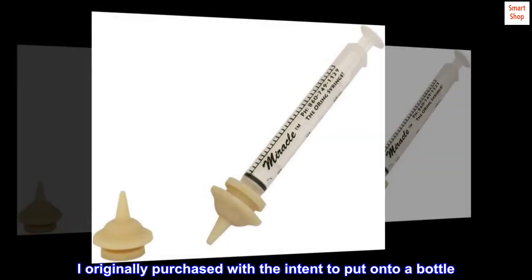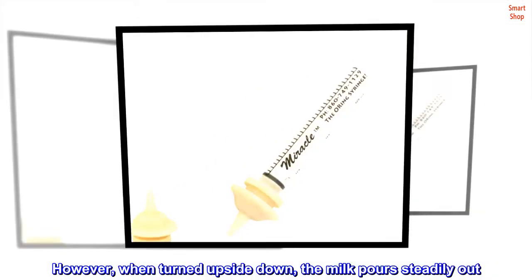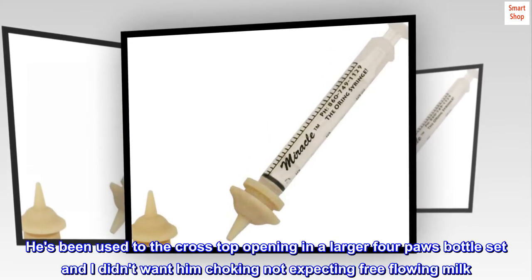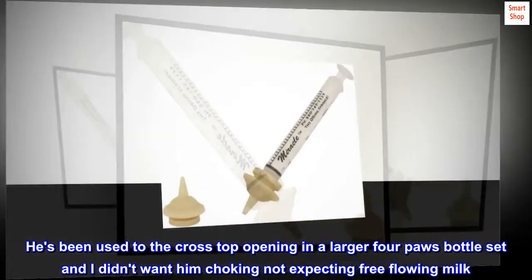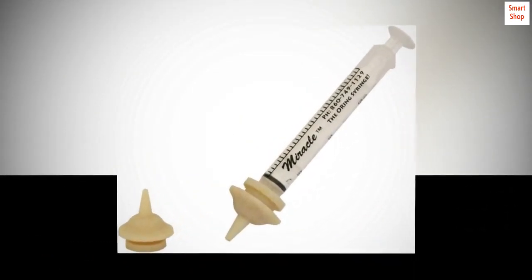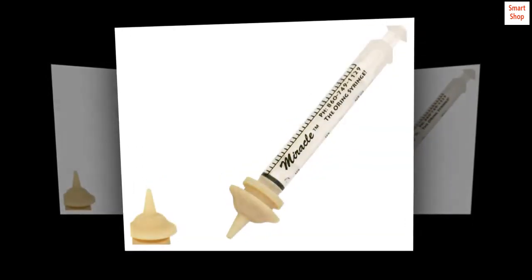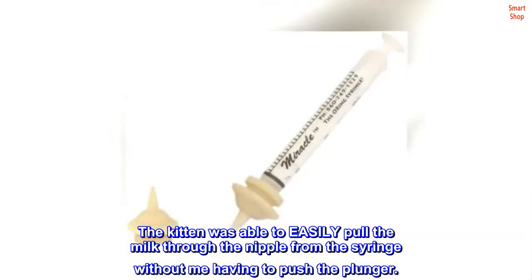I originally purchased with the intent to put it onto a bottle. However, when turned upside down, the milk pours steadily out. He's been used to the cross-top opening in a larger four-paws bottle set and I didn't want him choking not expecting free-flowing milk. I attached the nipple back to the syringe. The kitten was able to easily pull the milk through the nipple from the syringe without me having to push the plunger.